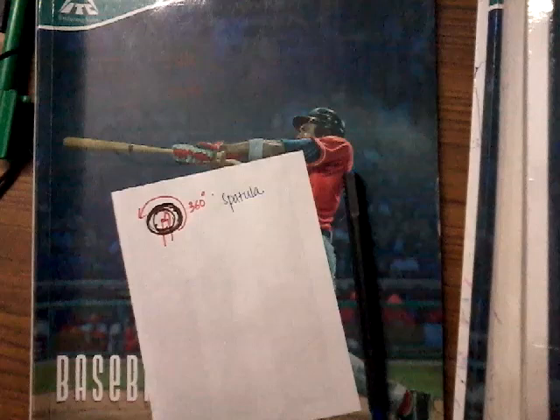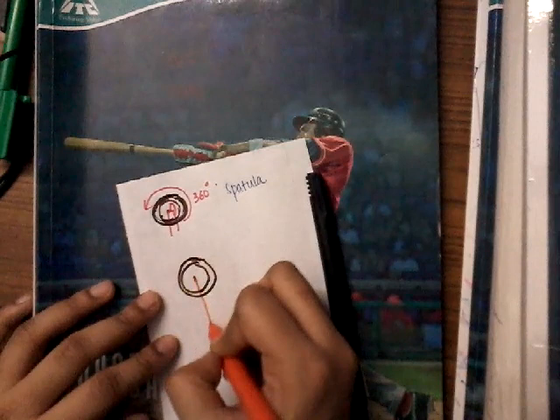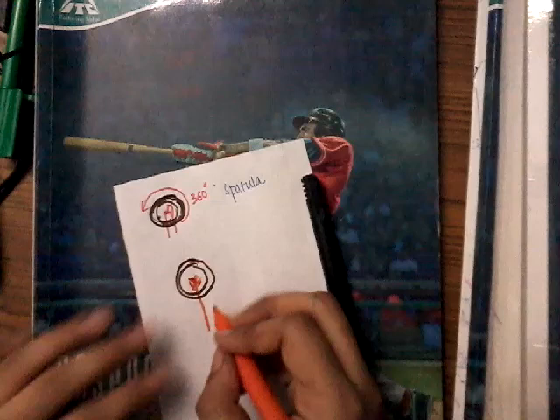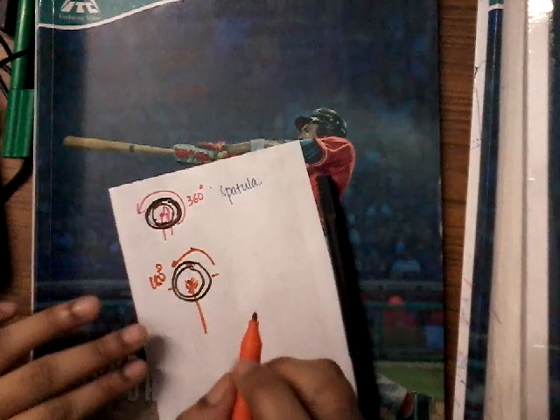For the cyto brush, you introduce the speculum, retract the anterior and posterior vaginal walls, then introduce the cyto brush. The cyto brush is rotated just 180 degrees, either clockwise or anti-clockwise. Then you put it on a slide, add a fixative, and send it to the laboratory.